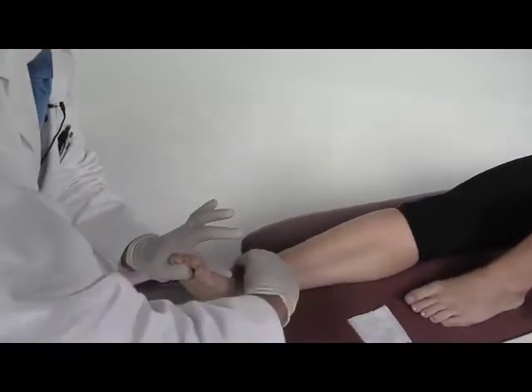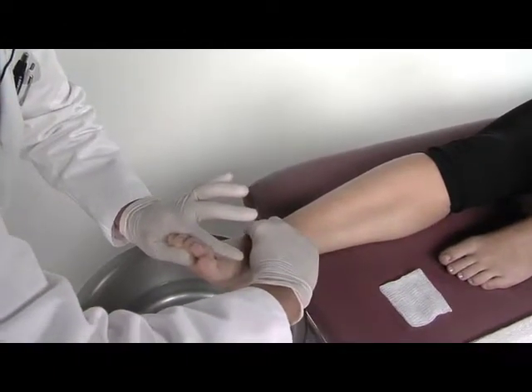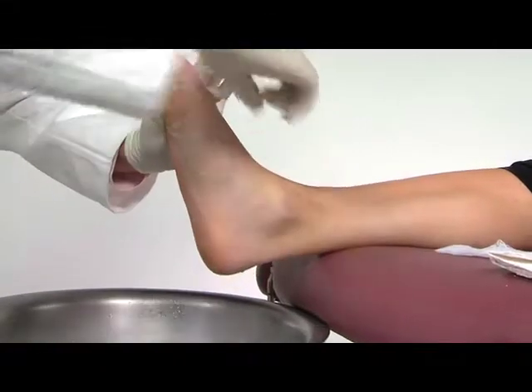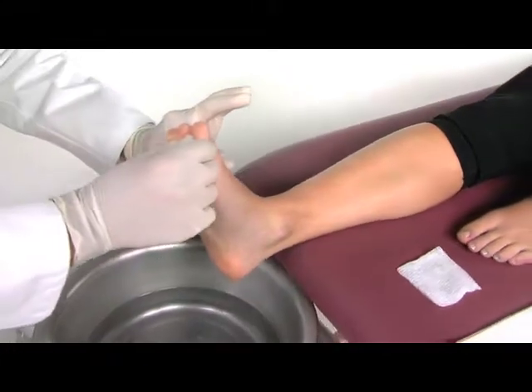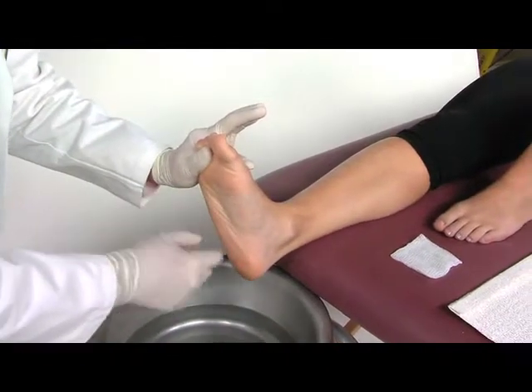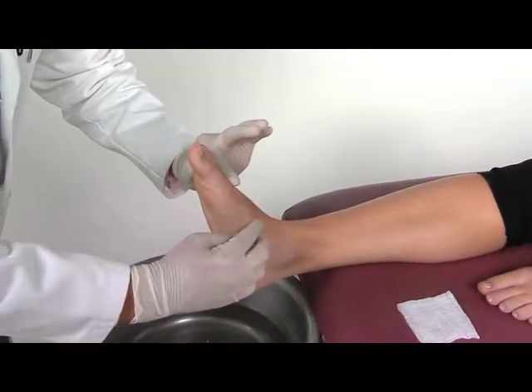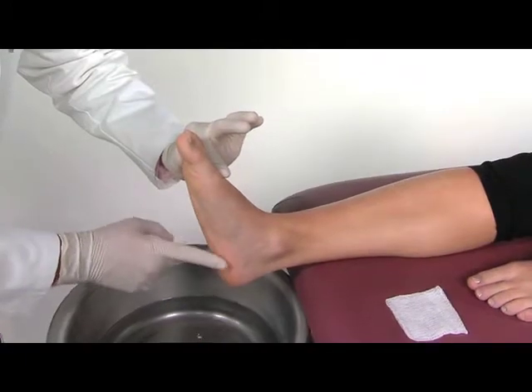We can palpate the talus head on the lateral aspect here with the index finger of your right hand — we are casting her right foot. Use your right hand to find the talus head, and then the medial aspect of the talus head with your thumb, moving it back and forth. I'm also taking the second toe and lining that up with the tibial crest to her knee up to her hip bone, looking for the toes to be in a position right about like this. As I hold her in position, her lateral column is going to be somewhat pronated, but just the mid-tarsal joints are pronated. The medial mid-tarsal joints are going to be somewhat neutral where the talonavicular joint is right where it's neutral, so we have this nice contour of her medial arch.